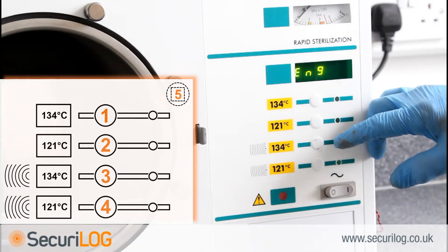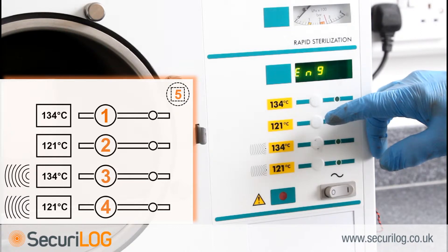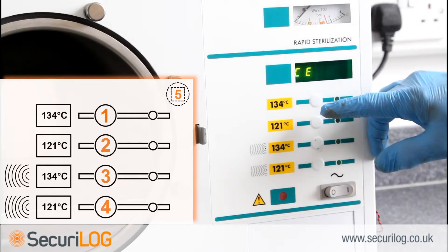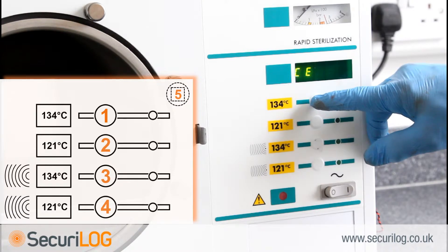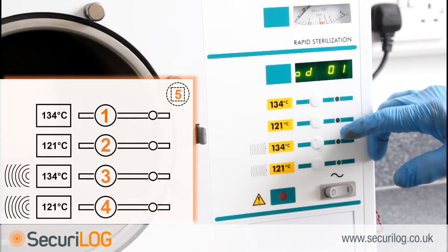To set the mechanical language, press button 1 to accept English as the machine language. If English is not the required language, press button 2 to cycle through other options; pressing button 1 accepts the selection. The display will now read 'CE'. To accept the CE mark, check the machine for a CE 0473 mark — if present, accept the selection by pressing button 1 to continue. If the machine displays no CE mark, press button 2 to continue. The display will now read 'OD01'.